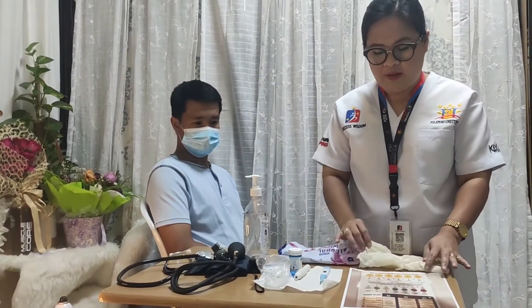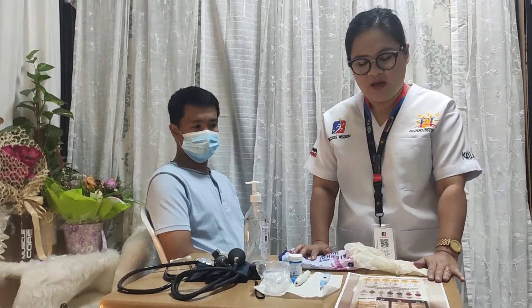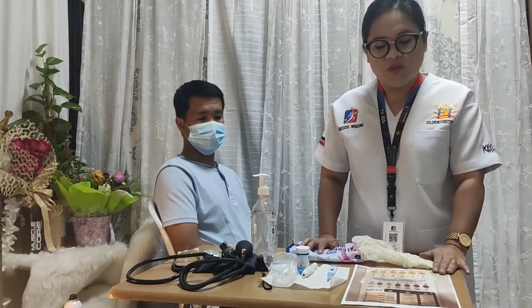The digital thermometer can be used axillary, orally, and rectally. I also have the pain assessment tools to assess the pain.